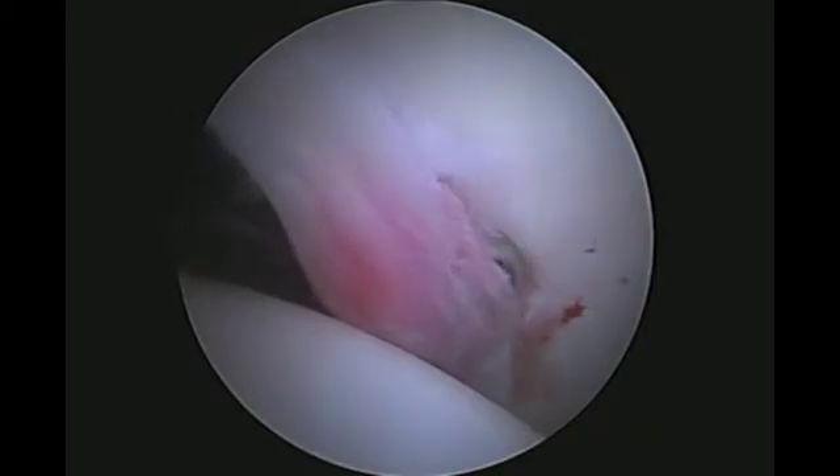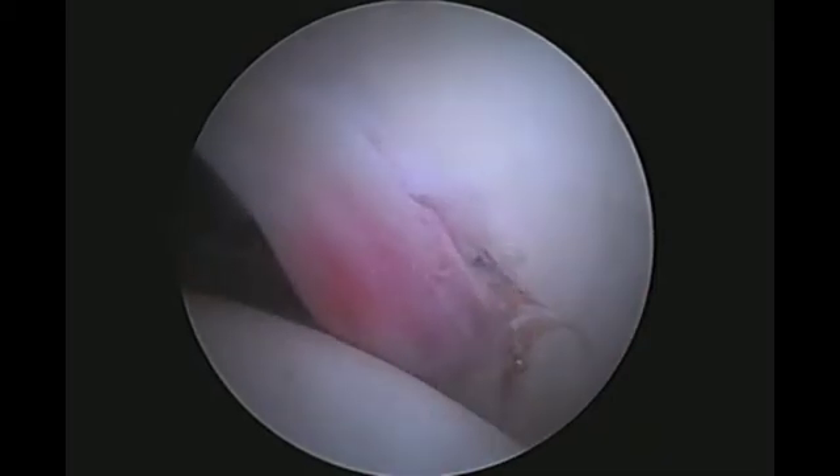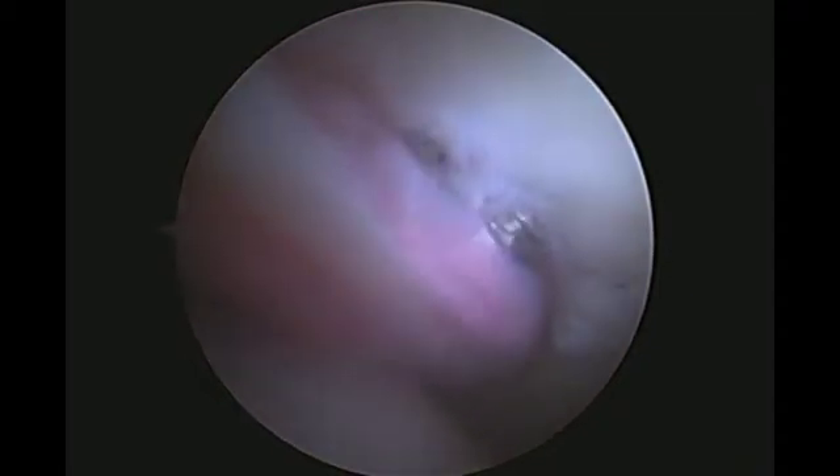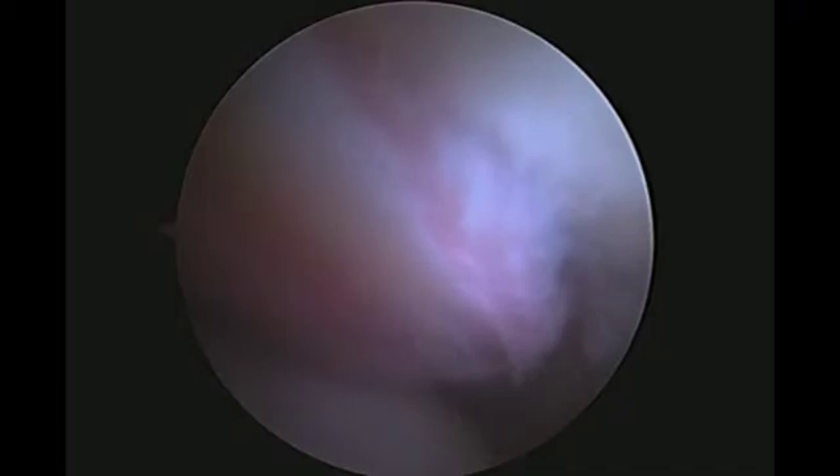A shaver is used to remove the fibrous tissue at the tear site and to perform a chondroplasty. A burr is used to gently abrade the acetabulum to promote healing. The labrum is now ready for repair.